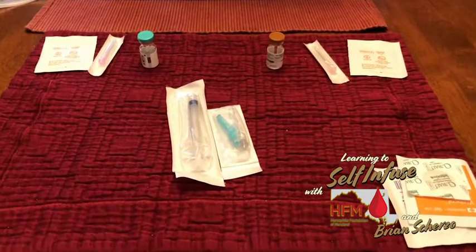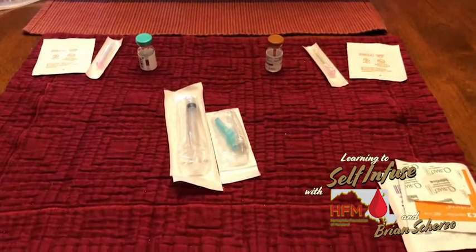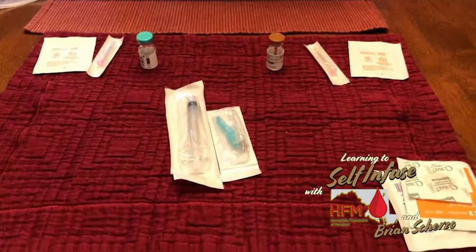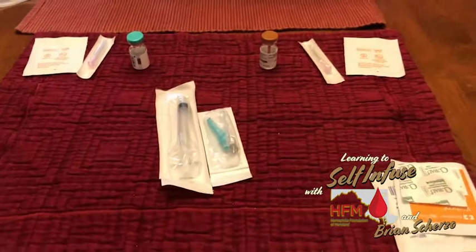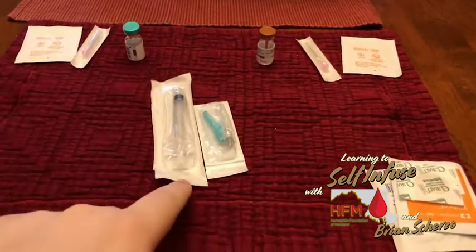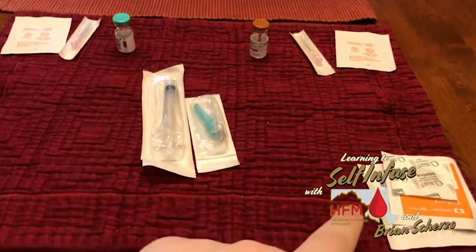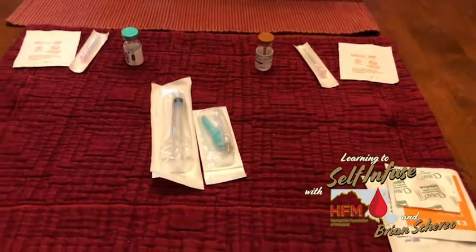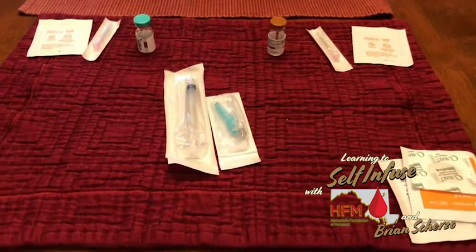I'm going to show you today how I go about my weekly Hemlibra injection. First step: you want to make sure you have all of your supplies laid out in front of you. I have my injection supplies, my draw needles, and my supplies to clean off my infusion site. Once that's all done, you want to make sure everything is ready to go and you can draw up your prescribed amount.